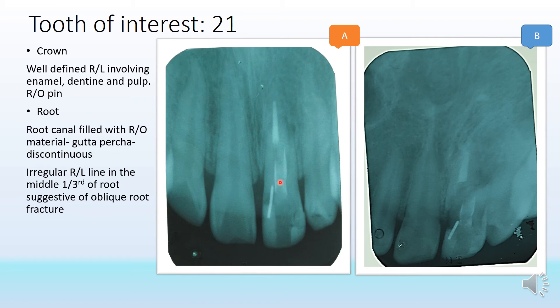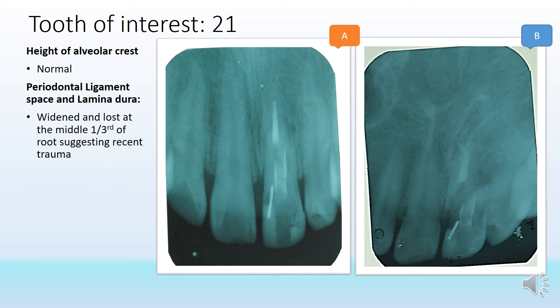In the root, it appears to be a root canal filled tooth with radio-opaque gutta-percha, but the gutta-percha appears discontinuous. Around the middle third of the root, an irregular line is visible suggestive of an oblique root fracture. There is discontinuity of the gutta-percha in that area. This can be easily confused by students viewing it for the first time, and a fracture would not be suspected without the second image confirming the fracture line.